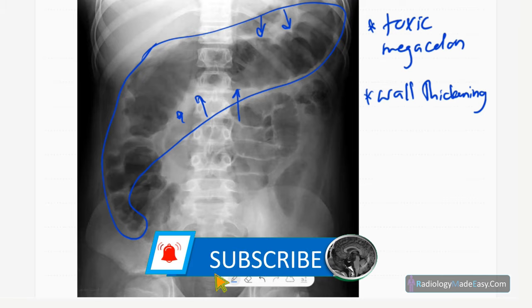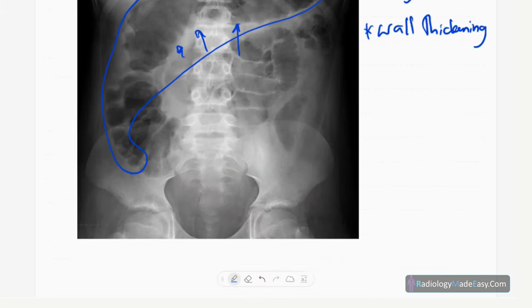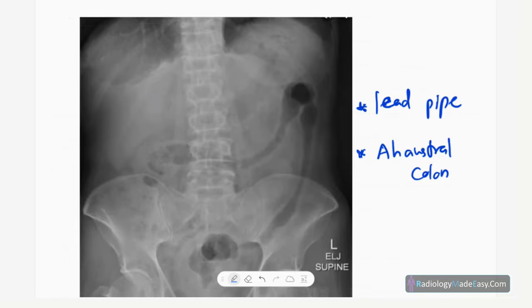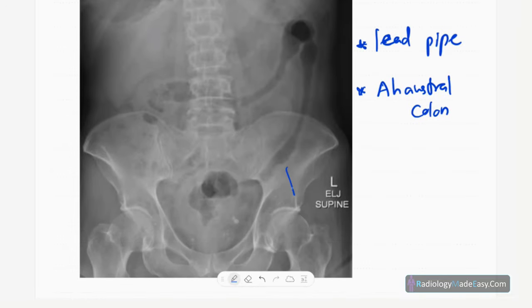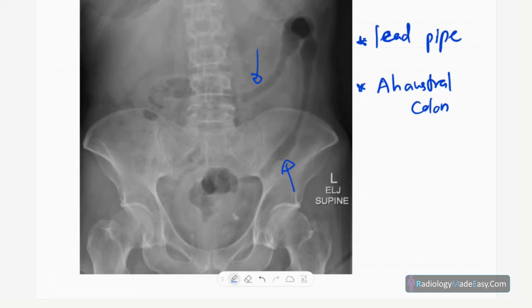The next X-ray shows another finding in inflammatory bowel disease. You can see continuous involvement of the descending colon and transverse colon — the haustra pattern is lost and the bowel lumen is narrowed. This is lead pipe appearance — a narrowing of the bowel lumen with wall thickening — a complication of ulcerative colitis.